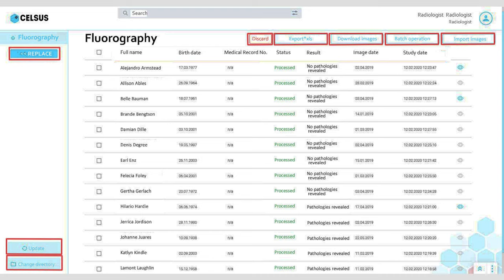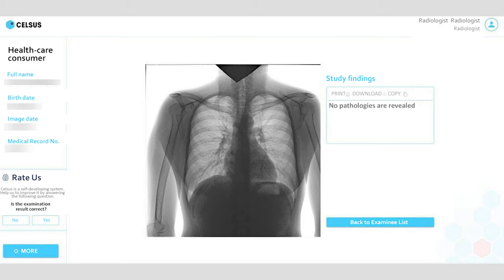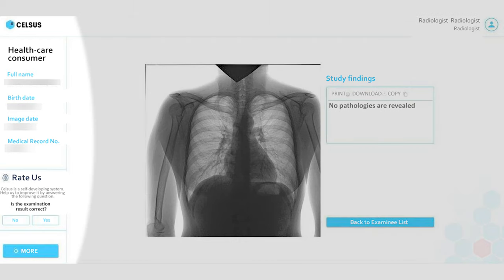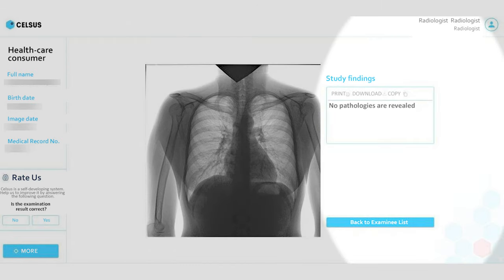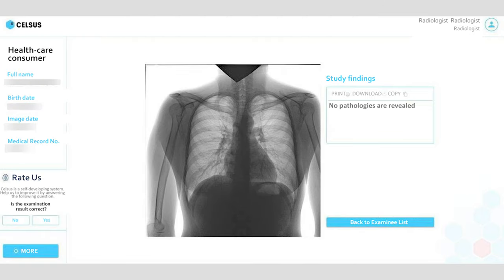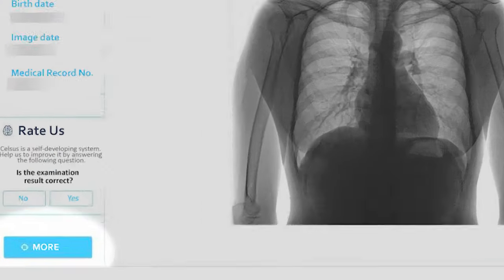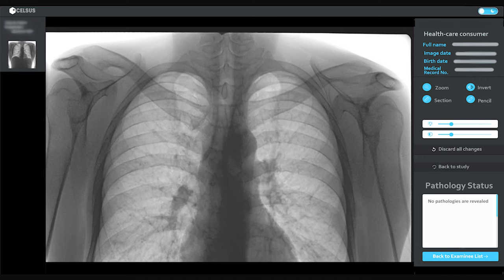Let's open one of them. Information about the study and the patient is displayed on the left side of the system. In the central part and the right part there is a text conclusion automatically generated by the system. We can hover the cursor over the findings and get acquainted with them in more detail. Different types of findings are highlighted by different types of selections.